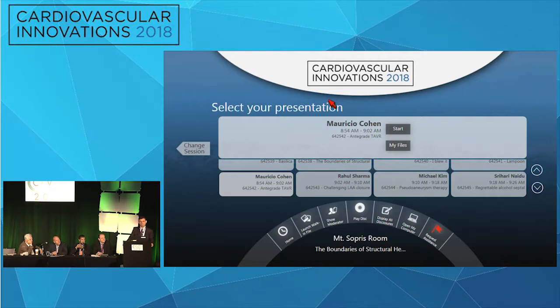2013. Was it performed with the new TAVR systems? Was it performed with Sapien 3? No Sapien 3 at the time. It was performed with the original Sapien and an Ascendra balloon. And the sheath was the original retroflex sheath that was like 24. I think this was a 23 valve. One of the things we learned is that the crimped valve would not go very well through the 24 sheath.